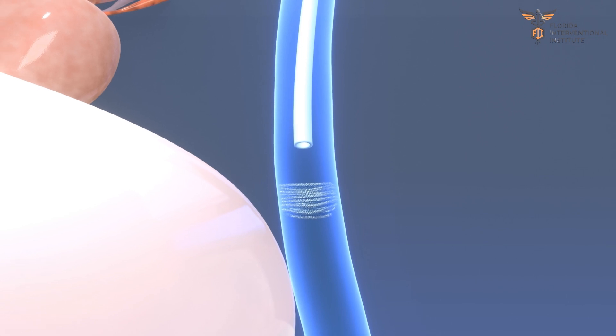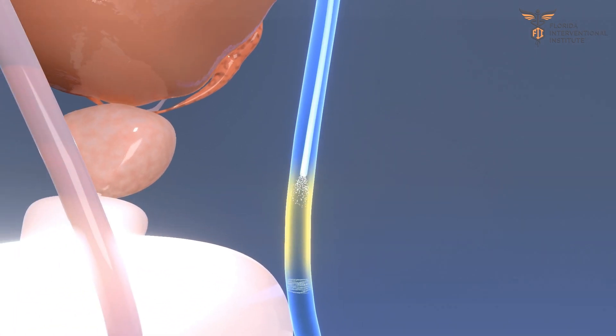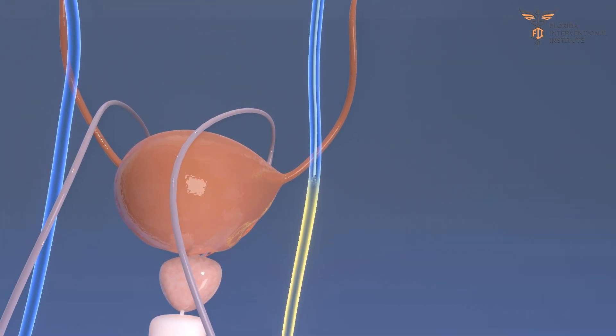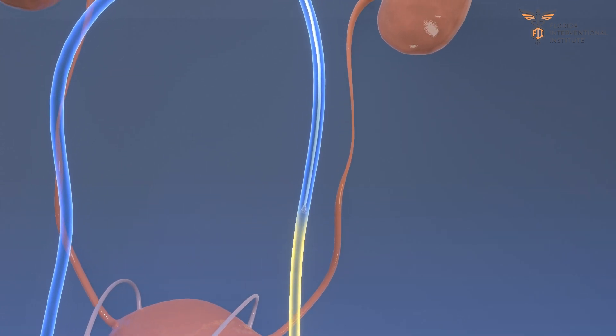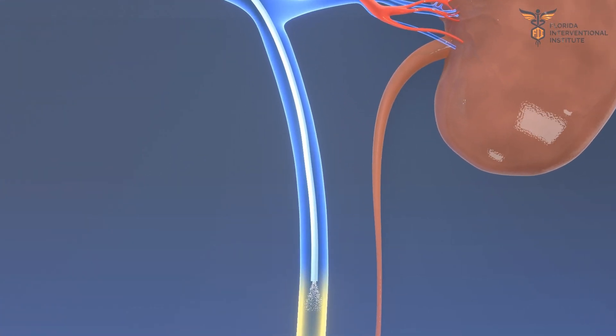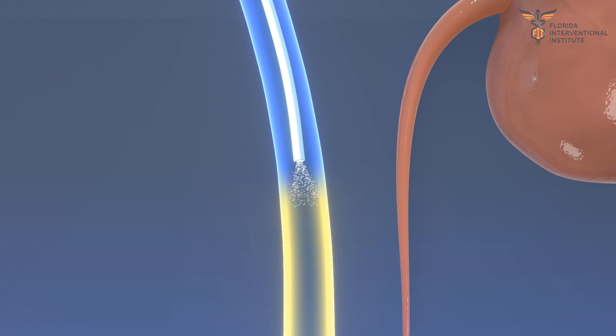Following this, a special medicine is injected into the vein as the catheter is pulled back. This medicine also helps to block the vein. Next, another coil is introduced and formed at the top of the gonadal vein.